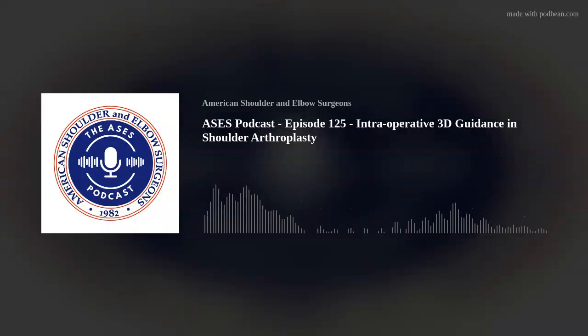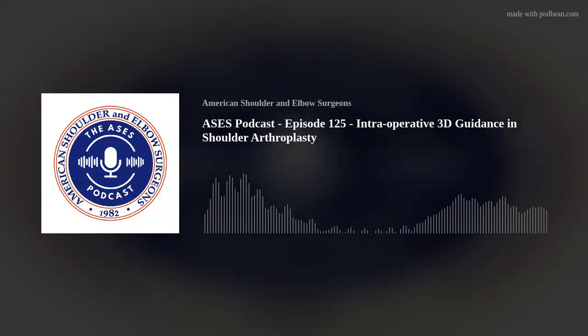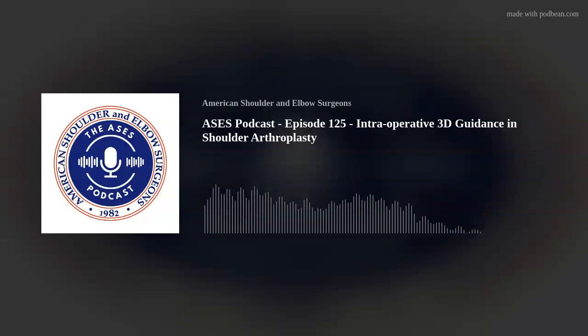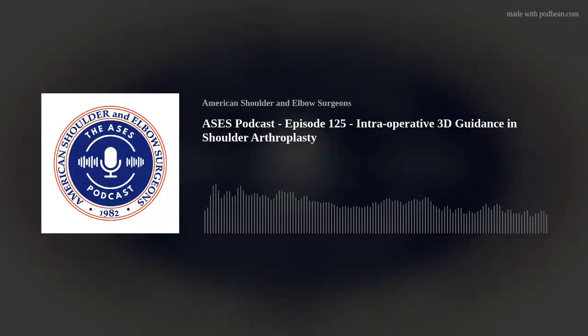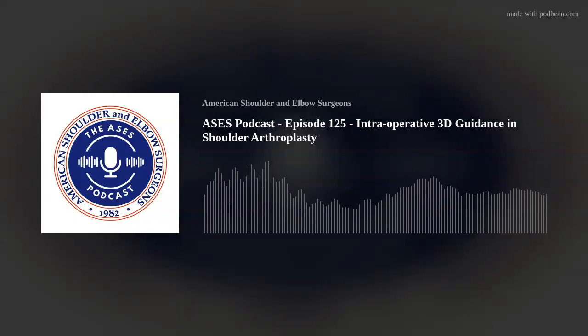We have a 30-degree half wedge as our largest augment, and I don't even need to use that most times to get back to 0 with a 5 degrees inferior tilt. The nice part is you can position that augment in any orientation. With it being circular, it allows for addressing all these off-axis deficiencies pretty easily with the system, and planning is nice for understanding that. What about you, Sumit? Just to add to that, thanks, Peter.